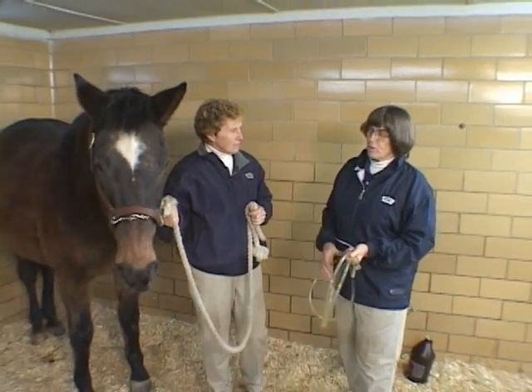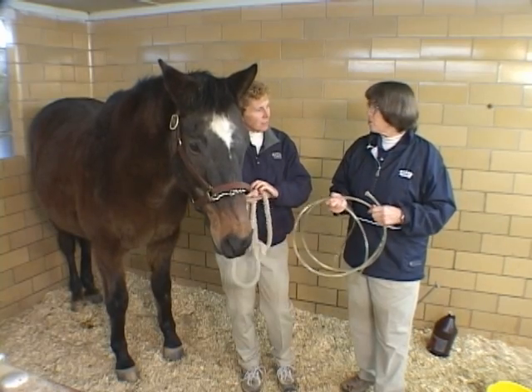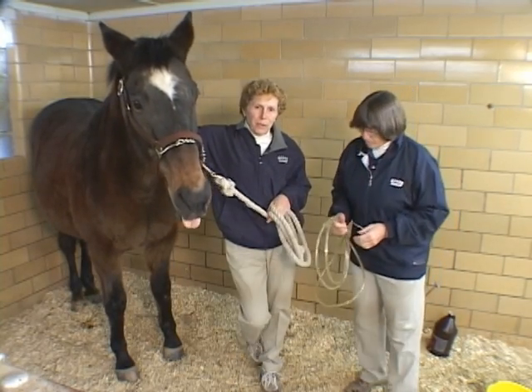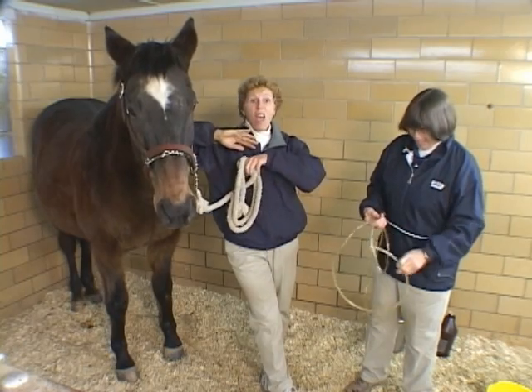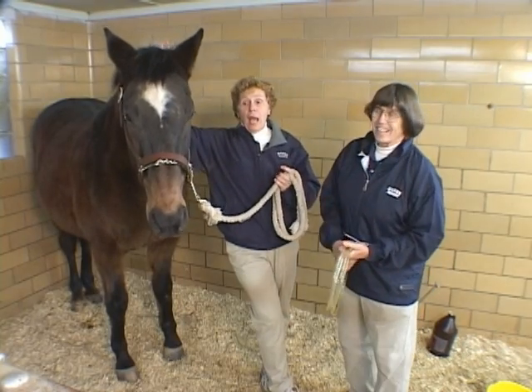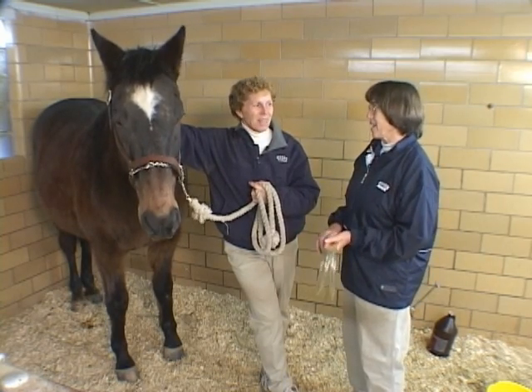One of our problems with tubing horses is that we have a very fragile nasal mucosa, and no matter how hard we try to keep our tubes nice and smooth and as gentle as we like to be, we can get some trauma and nosebleeds. This is undesirable but it does happen. Nosebleeds are a recognized complication of tubing horses — if you tube any number of horses you're going to have the occasional nosebleed. It's not serious, though it looks serious with blood everywhere. It's very annoying to the horse and he starts blowing it on you, on the client, on the walls. But nobody ever died from a nosebleed, so people have a tendency to panic but they really don't have to — and if you stay unpanicked, it helps the client stay unpanicked too.